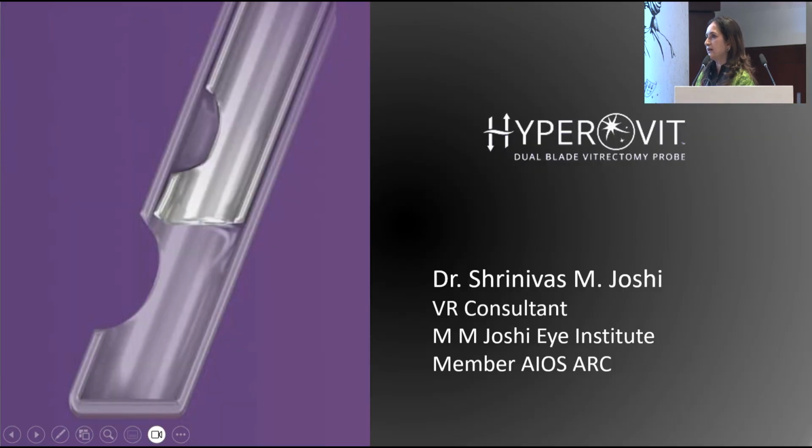So sometimes the PFCL may actually come in your way of dissection. At that time with the PFCL, you do a bimanual dissection. So yes, you actually can do it, but I'm usually able to clear up and identify my pegs and finish. It's what you are more comfortable with, but generally I think PFCL works best when you have to work anteriorly rather than when you work posteriorly.